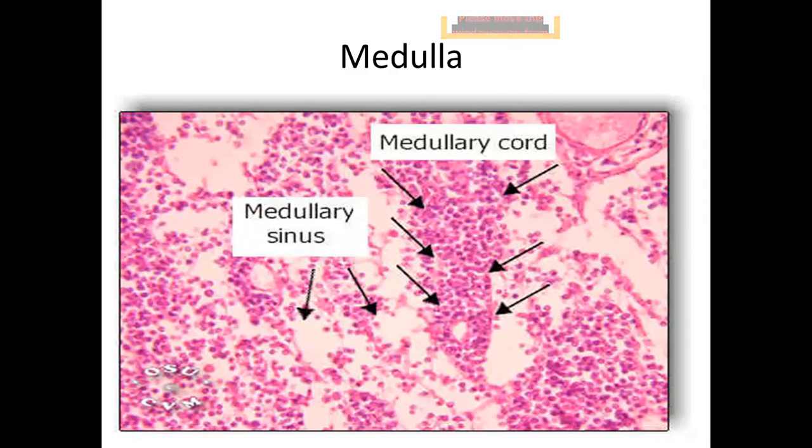It's the medulla. At the medulla, we also have large tortuous lymph sinuses surrounded by lymphoid cells organized in clusters known as the medullary cords. So at this site of the medulla, we have the medullary sinuses, which are the site of lymph drainage and continuous to the outer part of the node, and the medullary cords, which represent a site of accumulation of lymphoid or immune cells.